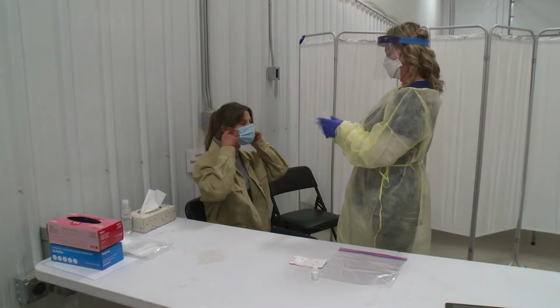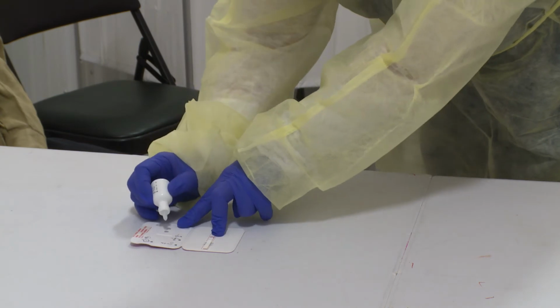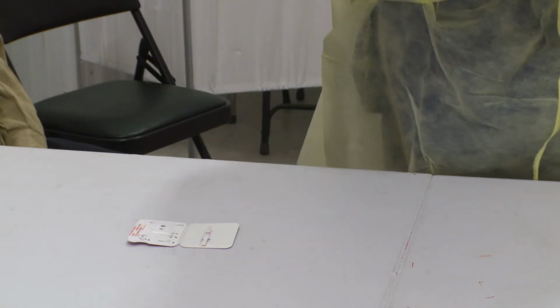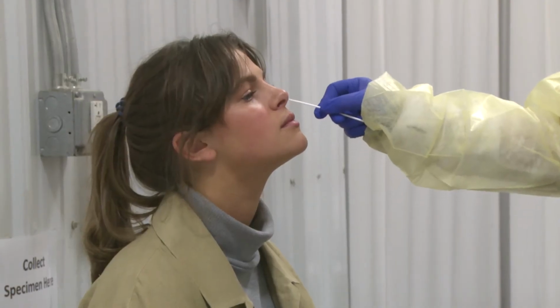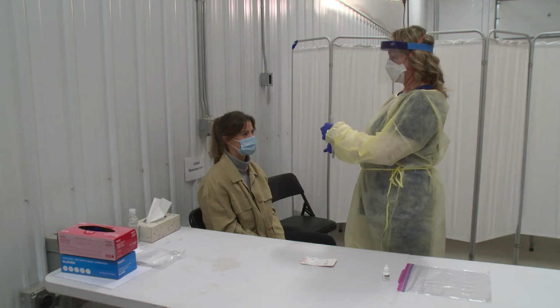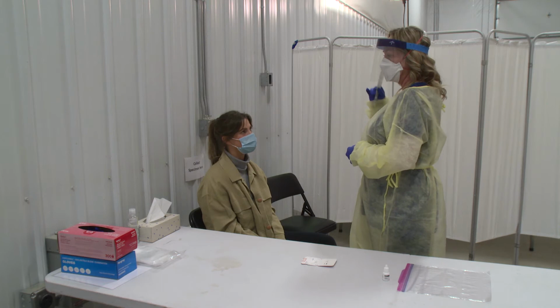So the medical professional then, within full PPE, will place 6 drops of reagent into the smaller top hole of the BinaxNOW card at the location of swabbing. They will then have the option of collecting the specimen by circling each nare 5 seconds with the sponged end of the swab, or they may choose to train the individual how to collect their own specimen in that moment.